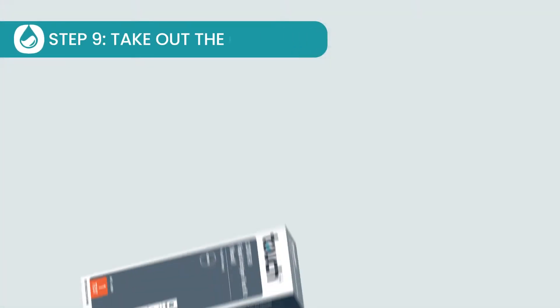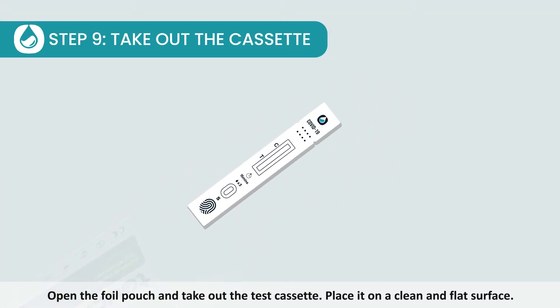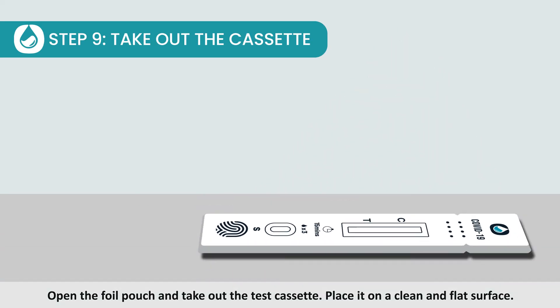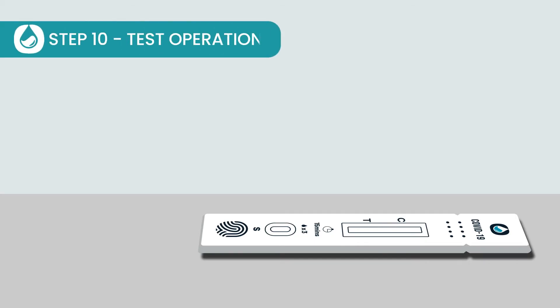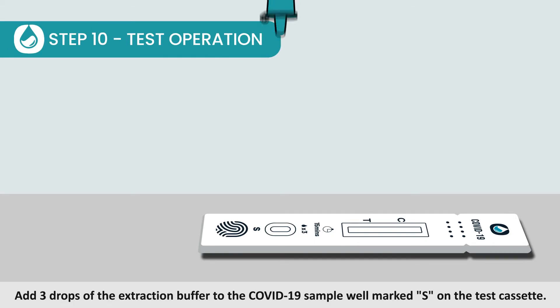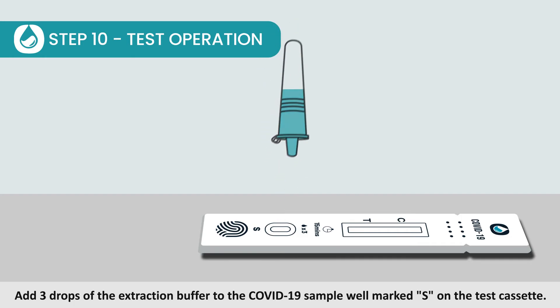Step 9: Take out the cassette. Open the foil pouch and take out the test cassette. Place it on a clean and flat surface. Step 10: Test operation. Add 3 drops of the extraction buffer to the COVID-19 sample well marked S on the test cassette.